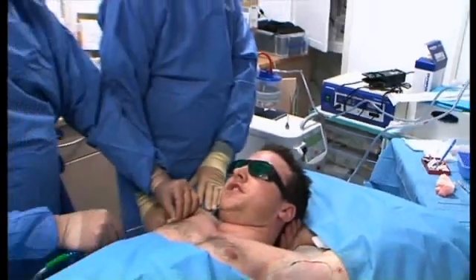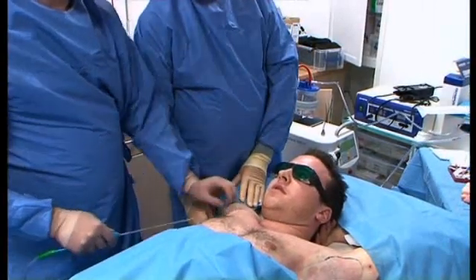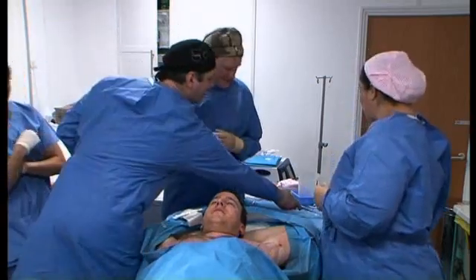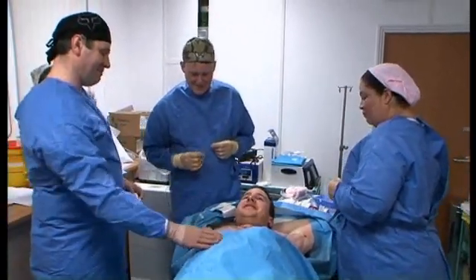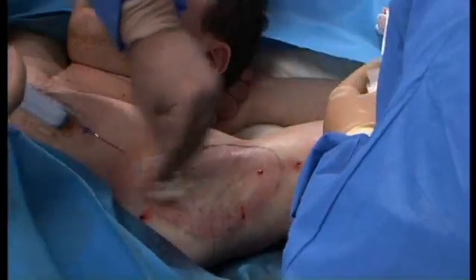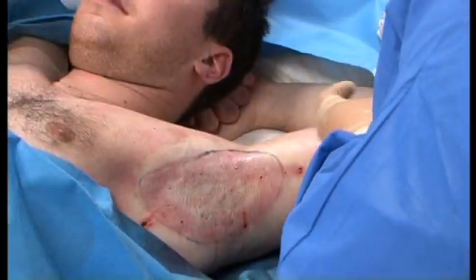But there'll be no dressing after the first three days. That's right. Only if it's oozy at all, but then it's a simple dressing. Okay. There we are, it's all finished! Okay, we're just going to clean you up. As that all gets a bit sticky, we let it dry for a minute or more. And then as it dries up, the first thing we do is the steristrips, please — upper and lower.